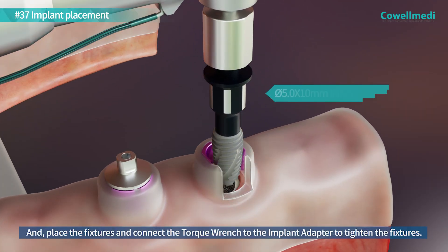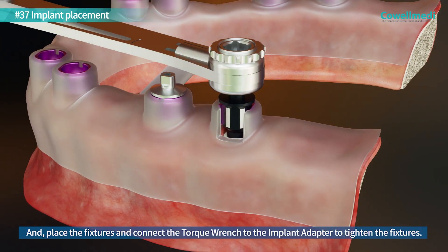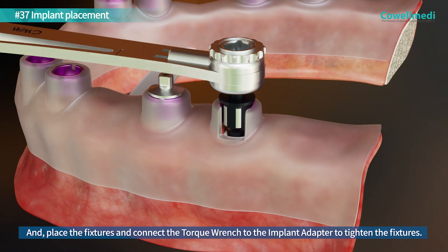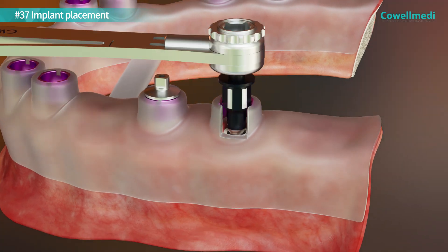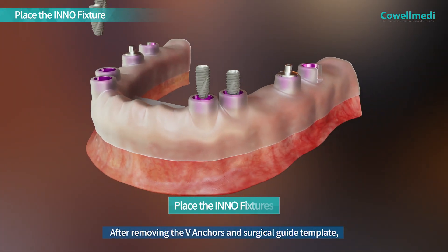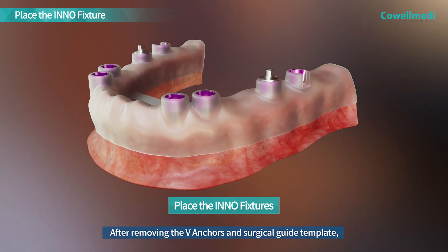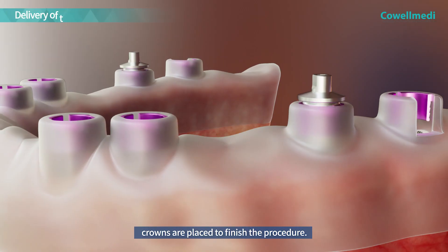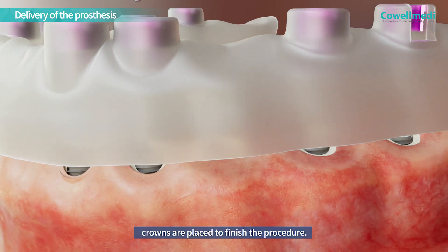Place the fixtures and connect the torque wrench to the implant adapter to tighten the fixtures. After removing the V-anchors and surgical guide template, crowns are placed to finish the procedure.